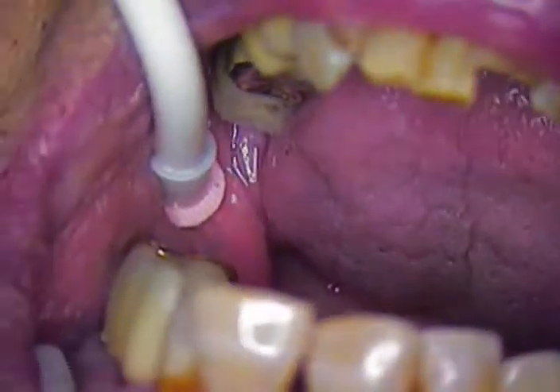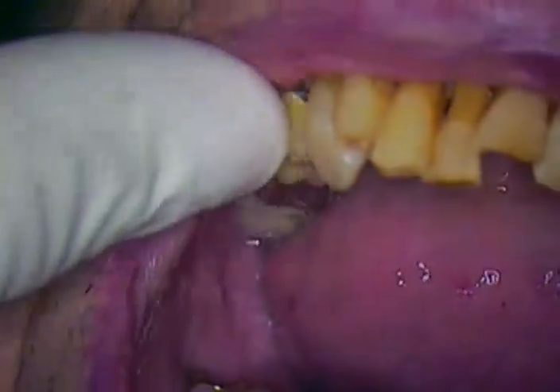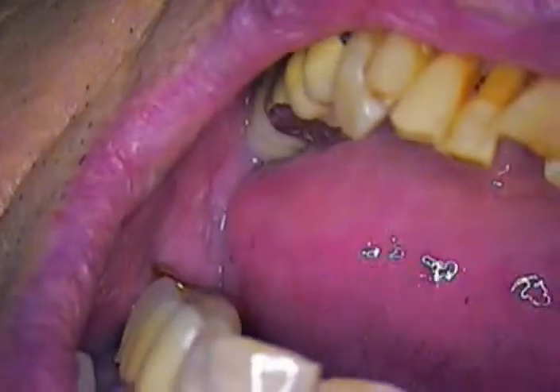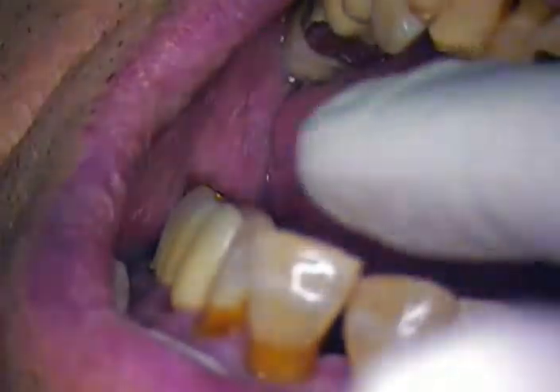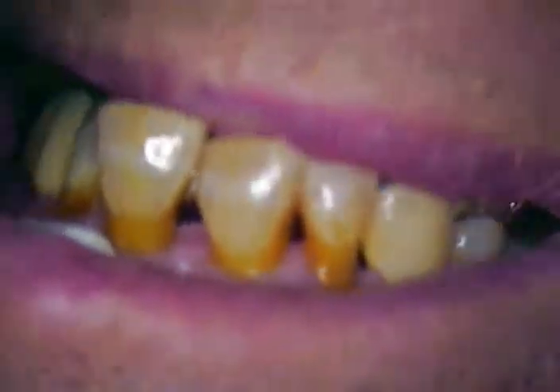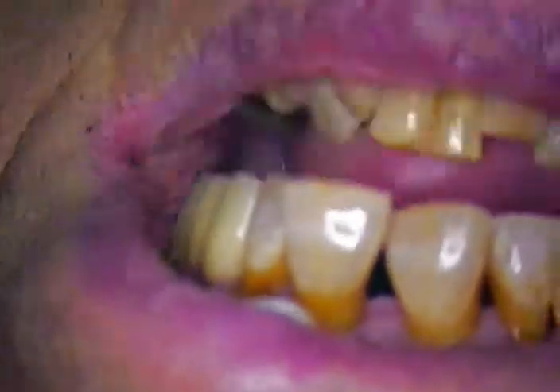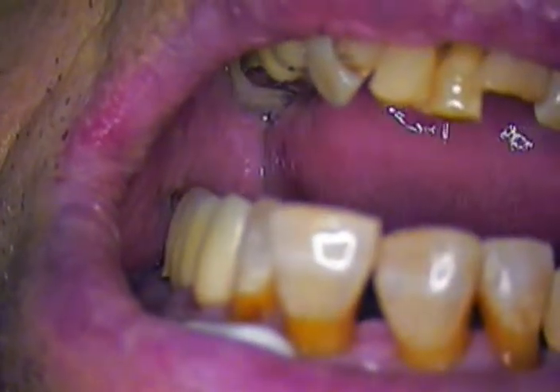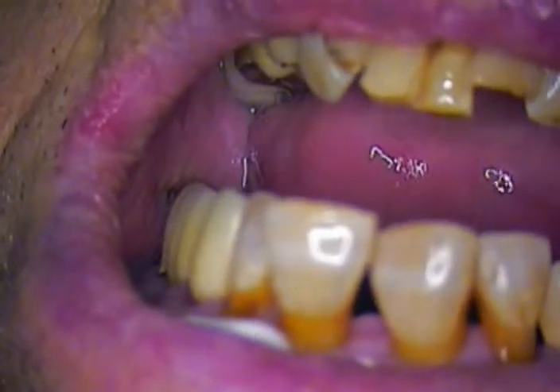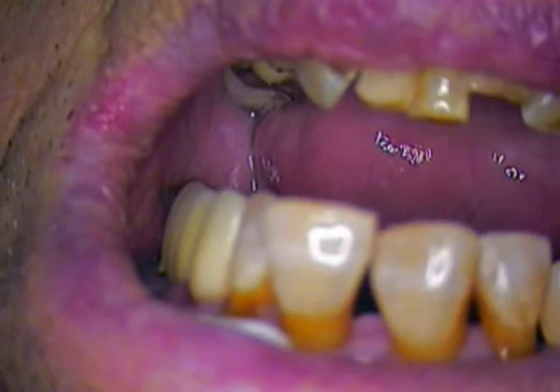Let's check the occlusion — that's the last bit. You can see now the highly polished tooth number 27 that we repaired and added to the labial surface to help with the group function on that side. We want force distribution on both teeth numbers 11 and 12, and leave number 13 a little bit out of occlusion. Go ahead and close on the paper — squeeze as hard as you can with a firm squeeze because we want all the other natural teeth to engage, although he's got implants on both sides. Tap, tap, tap — squeeze again. With that, we appreciate you checking us out on YouTube. Be open to any subscriptions or comments about this procedure or any future procedures you want to see — just give us a holler. Take care and have a great evening.